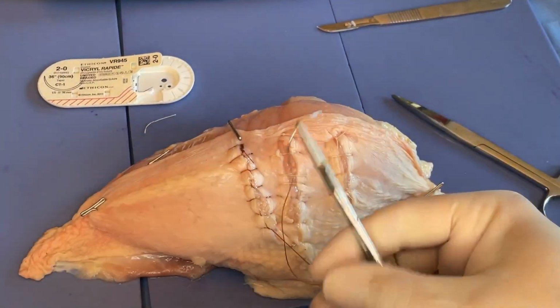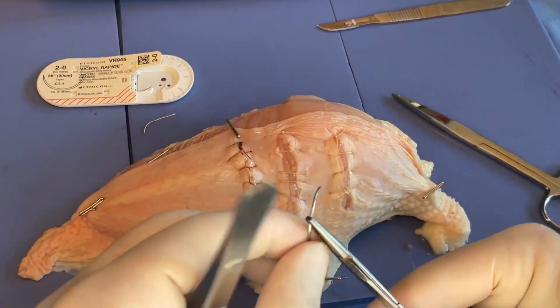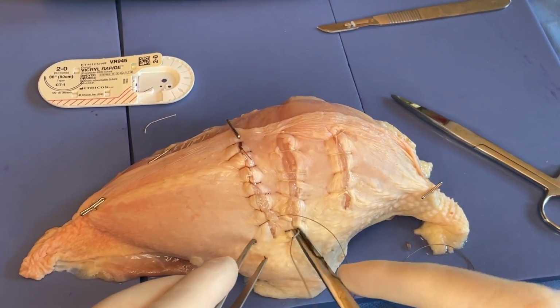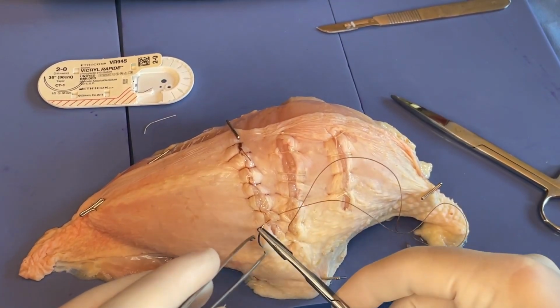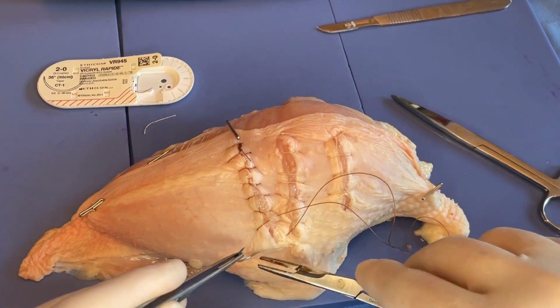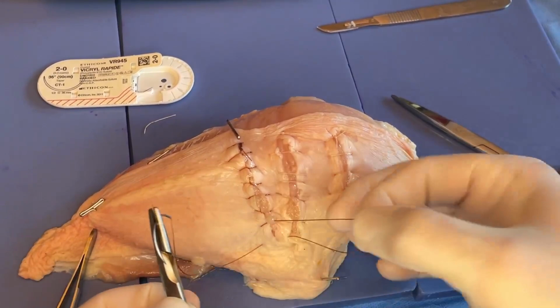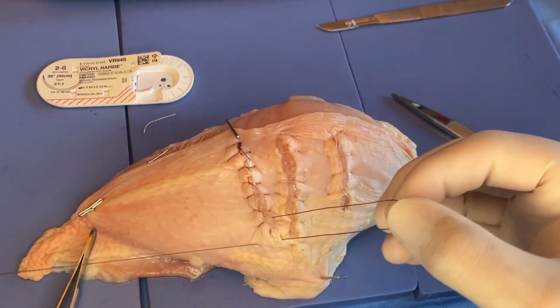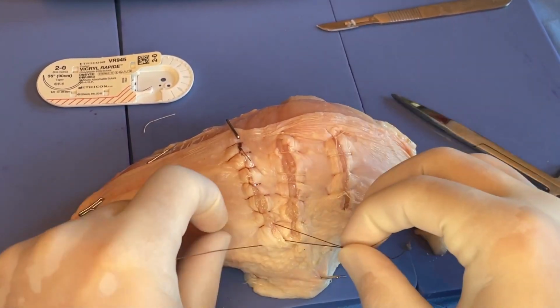All right, so we're almost to the end of this incision. We've got just a little bit left here. So when we go to tie this, I'm going to do one more bite that's right beyond the apex itself. And now, instead of reaching through the loop to grab the needle, because that would in effect just be locking it again, I'm just going to pull the needle through. We're going to protect it, pull the needle through. So now we have a loop on this right side and the single strand here. But we tie it just as we would as if this was a single strand over here.